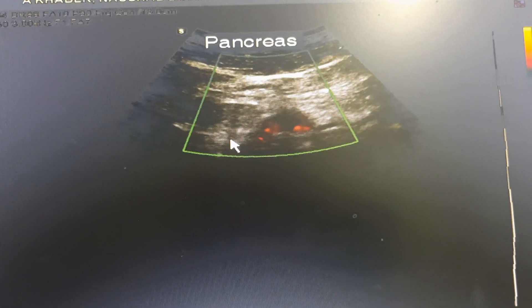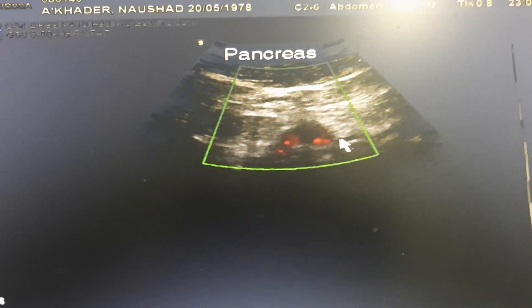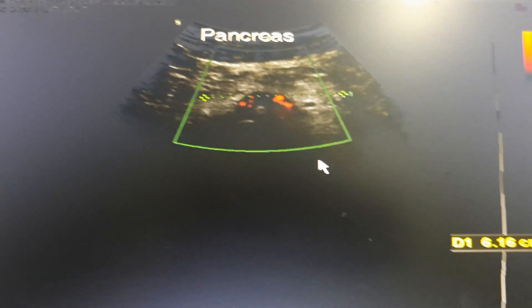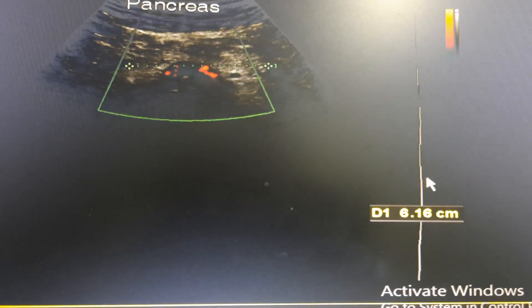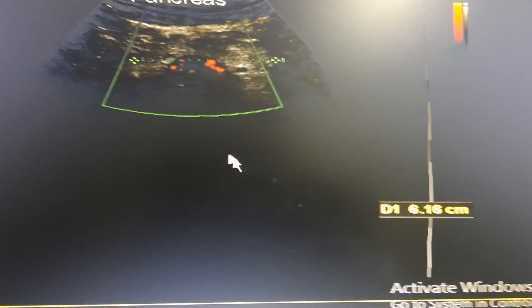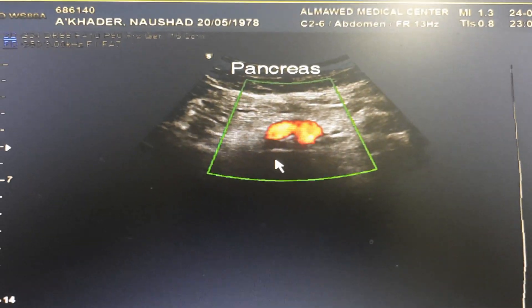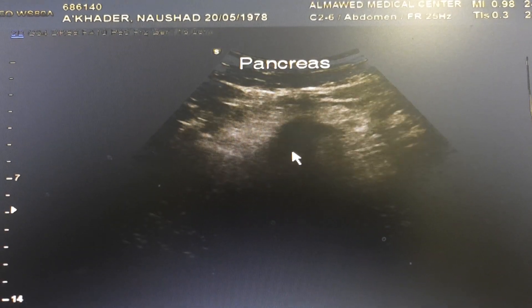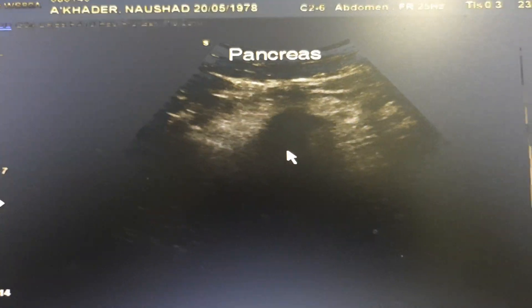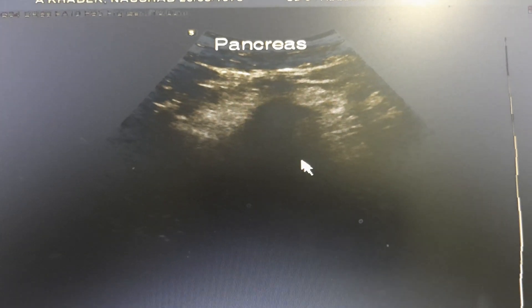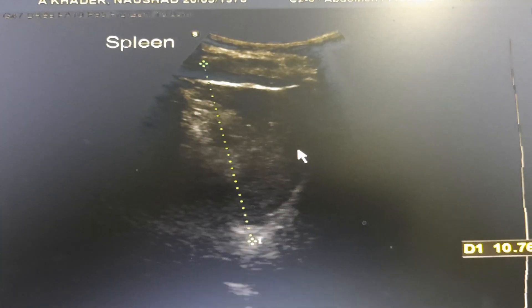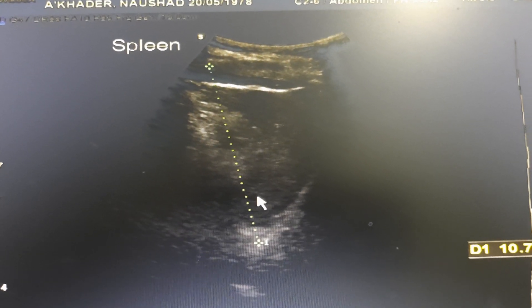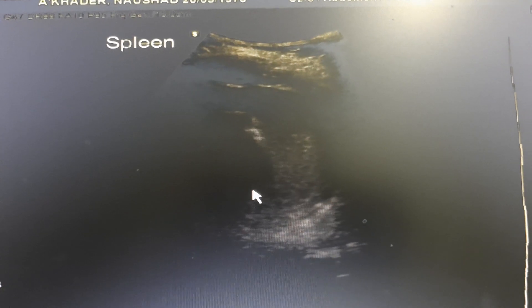Okay, that's the pancreas with its corresponding measurement. And the pancreas with color Doppler. This is the spleen — very nice.